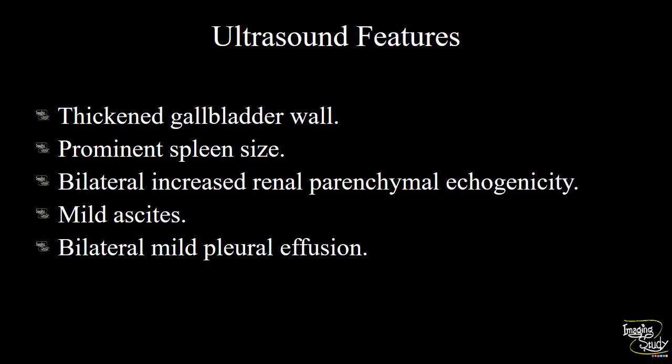Let's make a summary of the features seen. We have seen thickened edematous gallbladder wall. The spleen looks prominent for this 16-year-old patient given their body status, so we report it as a prominent spleen. Bilateral renal parenchymal echogenicity appeared increased, mild peritoneal collection (ascites) was present, and we have seen bilateral pleural effusion.